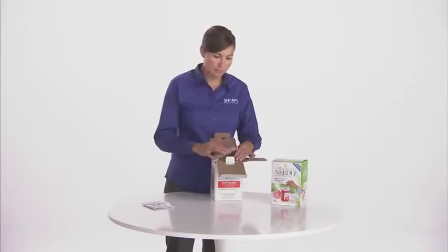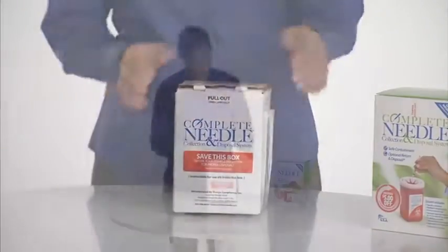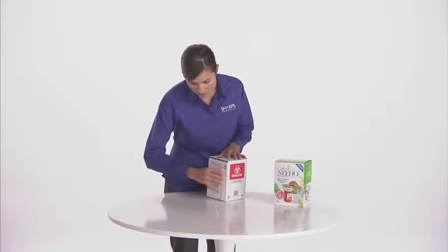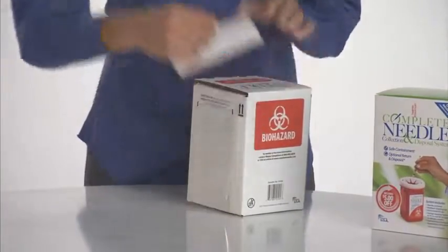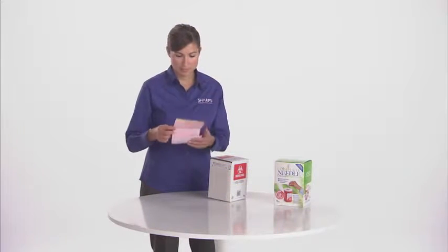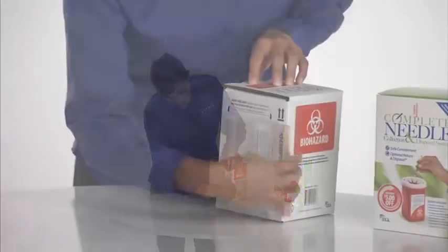Place the container back in the plastic bag lined return shipping box. Now simply close the numbered flaps. Secure the tab and tape. Remove and complete the tracking document — it's located in a plastic zip bag on the outside of the pre-approved return shipping box. Complete the top generator section, then remove the bottom copy and keep it for your records.